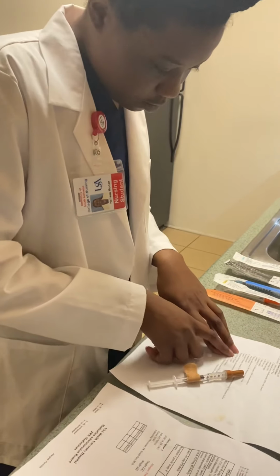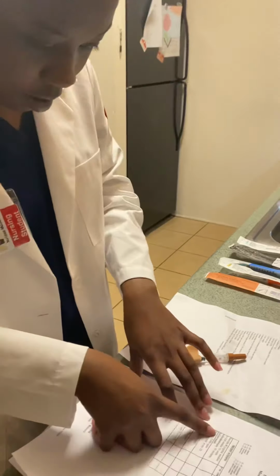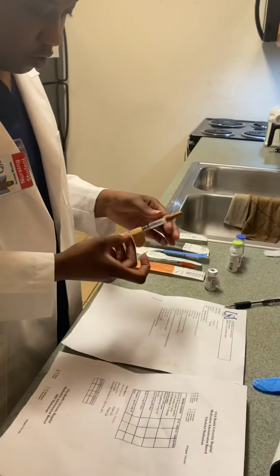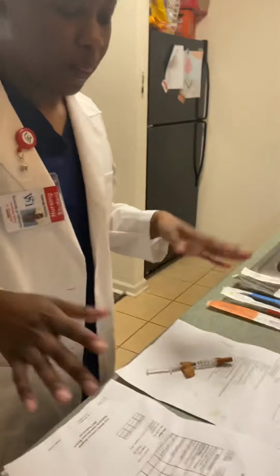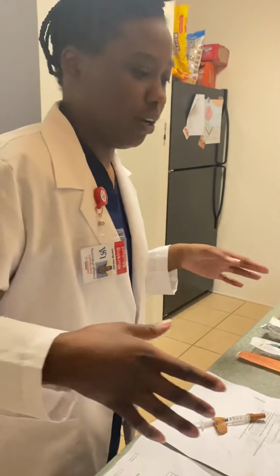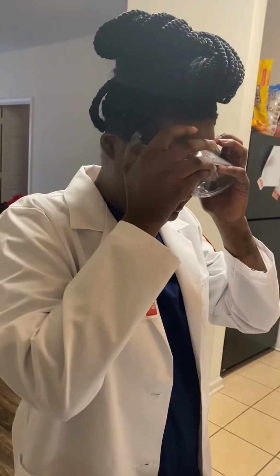And I'm going to check one more time. Heparin, 5,000 units subcutaneously every 12 hours. And I do have 0.5 milliliters in here. So once I have done hand hygiene and let him know, I will raise the bed up to working level and lower the side rails. Put on my goggles and my gloves, and I'll be ready.